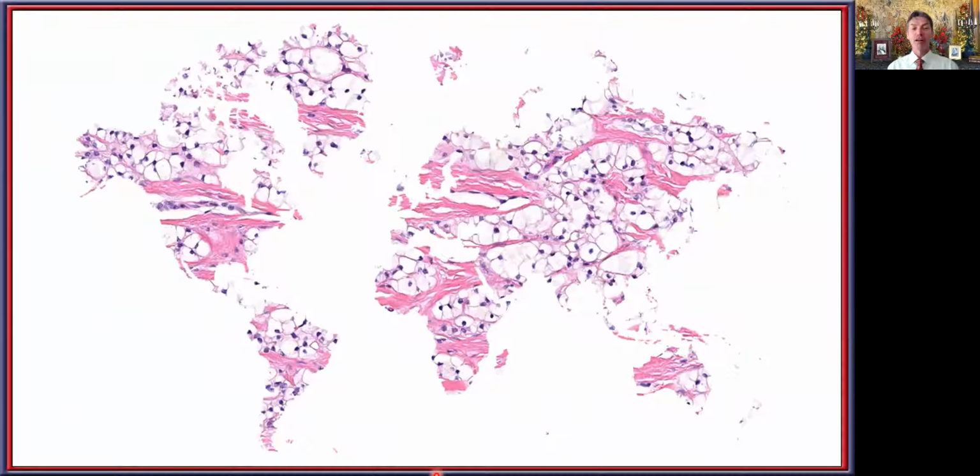So with that, I hope that I have been able to clear up some of the findings that you can see in salivary gland clear cell tumors, especially with their differential in the head and neck that will encompass some of the other tumors in the lesion.